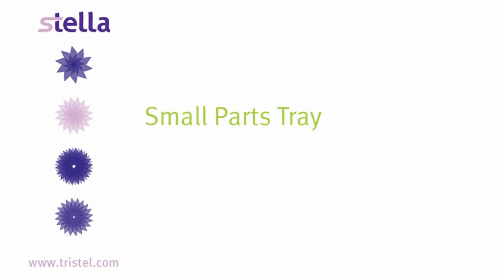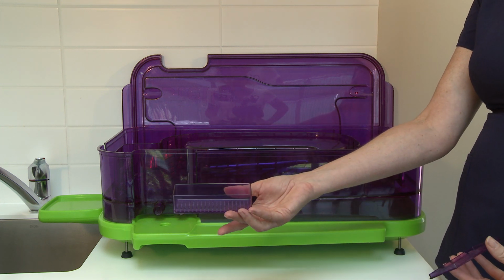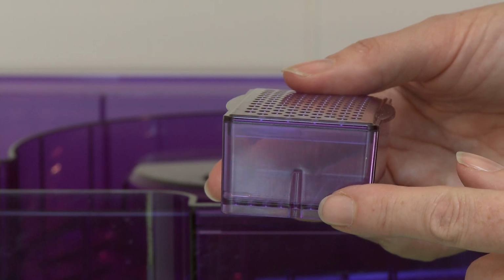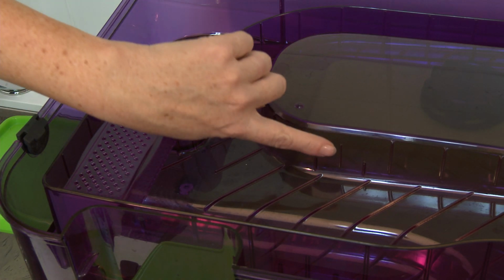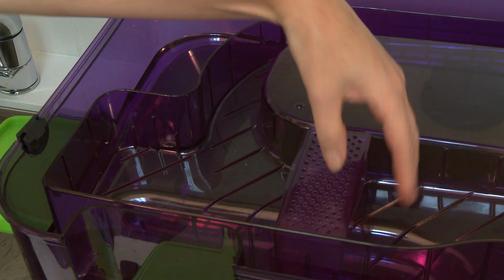Small parts tray. Some instruments have detachable taps or bungs that need to be disinfected. Disassemble the instruments and place the small parts in the small parts tray of the base. The small parts tray can be positioned at the front of the inner compartment of the base on either the left or right side. The tray fits into designated slots.